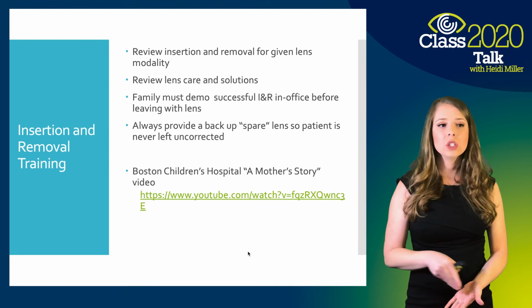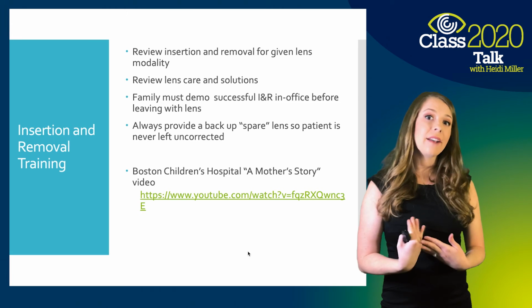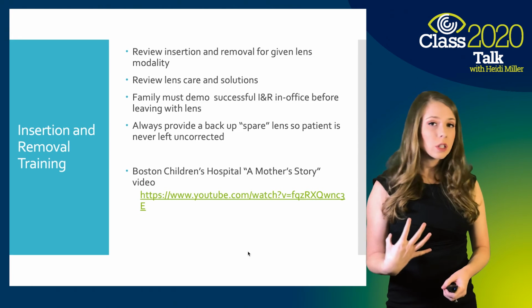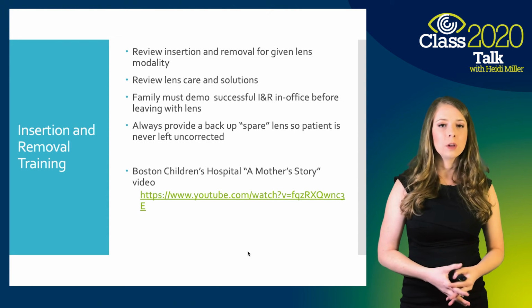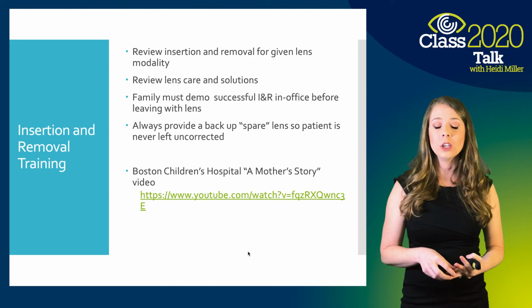With all patients, you want to make sure you're doing a really thorough insertion and removal training. It doesn't have to be you personally. I don't actually do the trainings. I have a technician that does that for me. I've trained her really well on all my expectations and everything I want her to review.